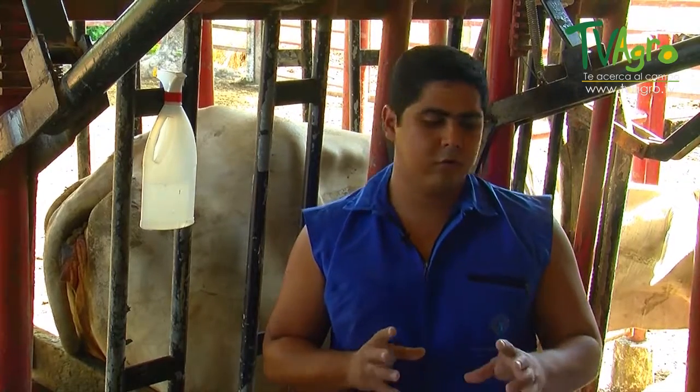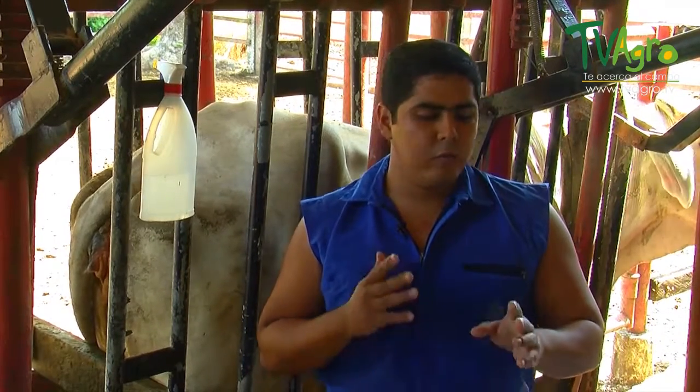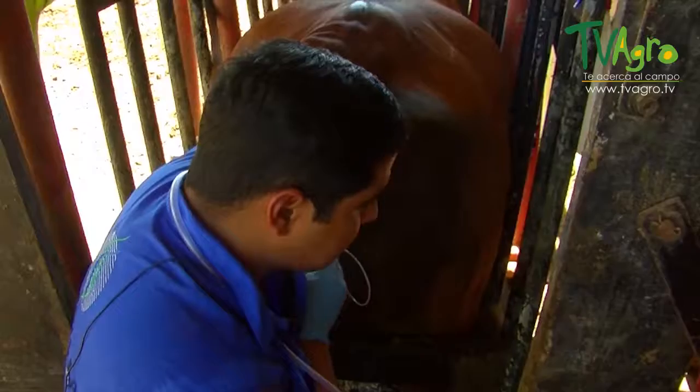You want to pull the needle out as little as possible. You want to take the follicle to the needle and not the needle to the follicle in order to prevent some of the different complications that can arise if this procedure is not performed correctly, such as adhesions or hematomas. But those problems can be avoided as long as the technician is careful and has the experience required to perform this procedure.